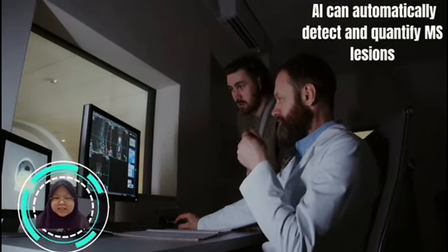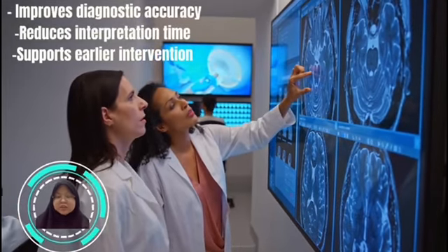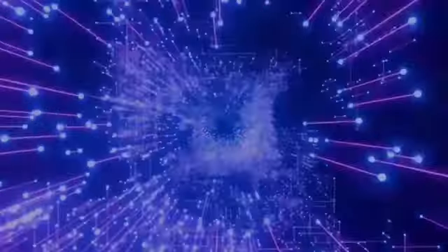AI can automatically detect and quantify multiple sclerosis lesions, helping the radiologist identify subtle abnormalities faster and more consistently. This improves the diagnostic accuracy, reduces the interpretation time, and also supports early intervention, which is critical for preventing permanent neurological damage.